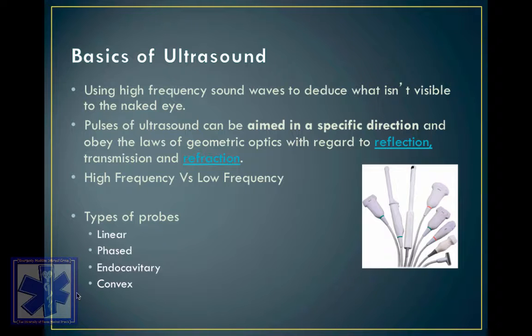So it's great for vascular structures. It's great for looking at an abscess, putting an IV in, doing IJs, things like that. Not good for looking inside the belly, looking at the heart. But it is pretty good for looking at your thorax too, because you don't need to go very far to see what you need to see.